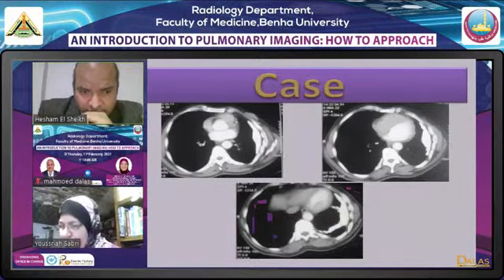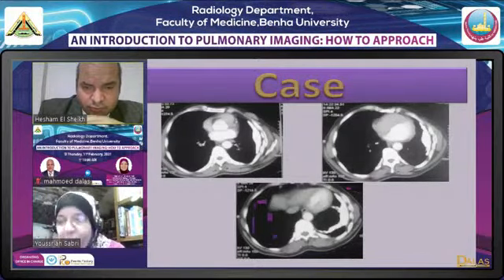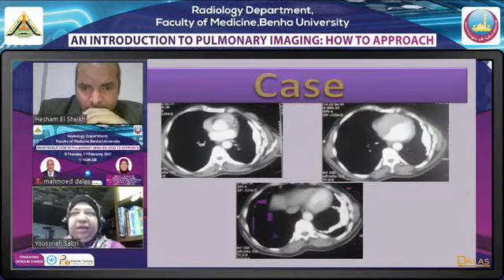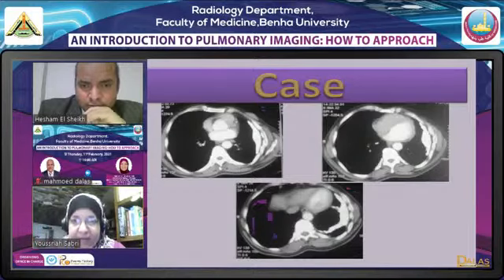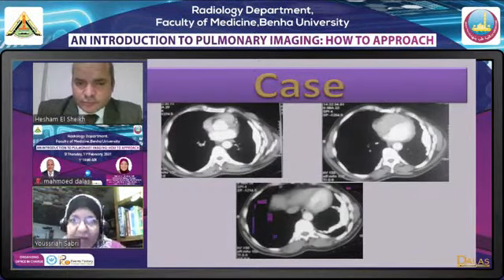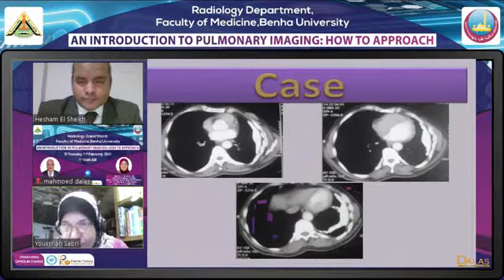Another question, دكتورة يسريه, how to differentiate cicatricial fibrosis from honeycombing. قلنا ده وهي ما فيش حاجه اسمها سيكاتريشال فايبروزس. يعني هي سيكاتريشال معناها فايبروزس، هي سيكاتريشال كولابس. تمام؟ السيكاتريشال كولابس تاني بيبقى لوب اوكي ماركت بفوليوم لوس. الهاني كومبينج bilateral fairly symmetrical subpleural predominantly basal with filling the pleural recess of clusters of cysts, total different appearance.